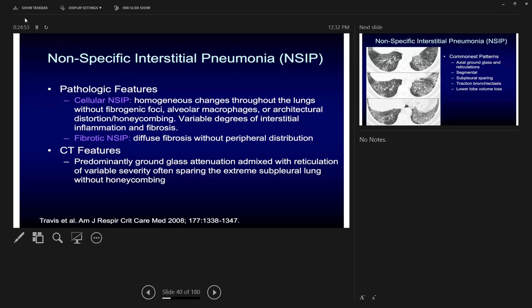For exam purposes: if you see predominant ground glass on CT, you take UIP off your differential. But clinically, UIP is not the same as IPF — UIP is just a radiological pattern, and NSIP is also a radiological pattern. Either can be caused by many things. UIP on CT does not necessarily mean you will see UIP pattern in the pathology, and vice versa.